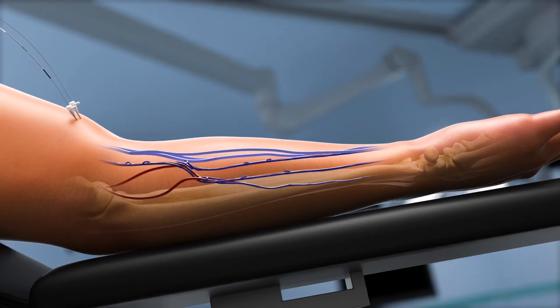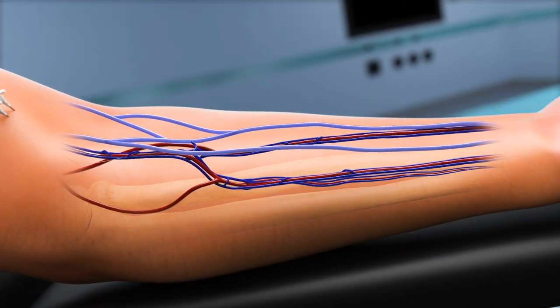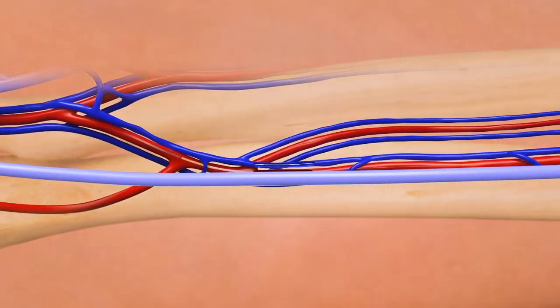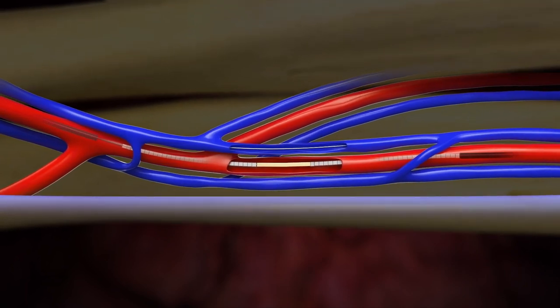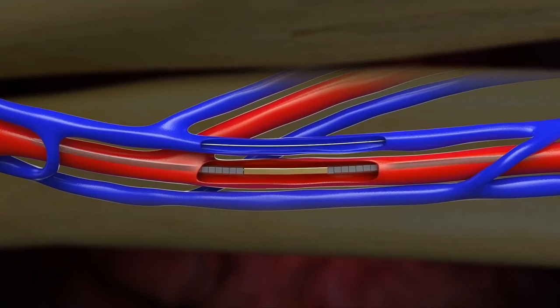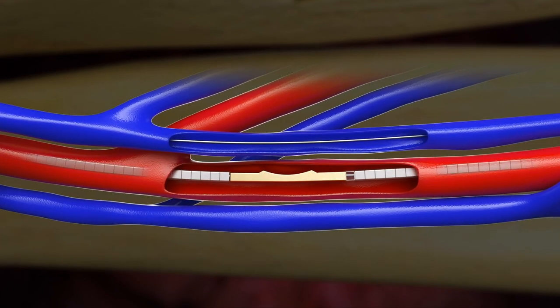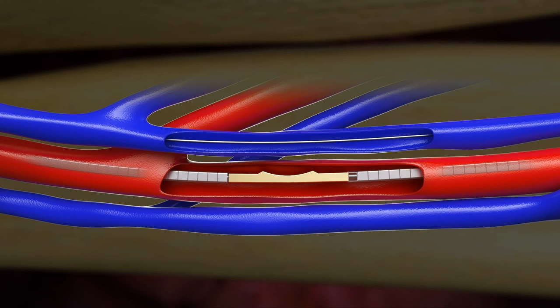After venous and arterial access have been achieved and guide wires are in place, advance the arterial catheter over the guide wire and through the arterial sheath into the brachial artery. Under fluoroscopic guidance, advance the catheter to the target Endo-AVF site. Next, rotate the arterial catheter until the illumination of the rotational indicators appear as open boxes, and the peaks of the backstop are pointed towards the target vein.